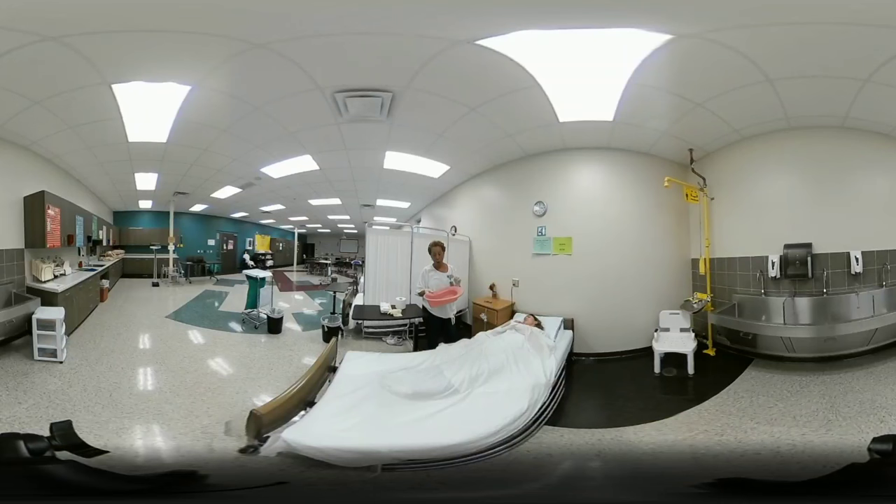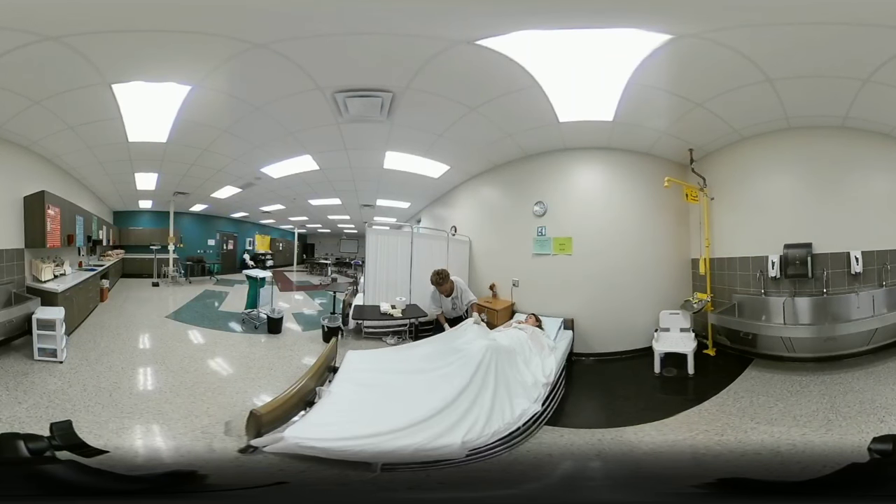When placing the bedpan — even though it's no longer a critical element — the step still requires you to place it correctly under the client's buttocks. The bedpan has a wide angle and a narrow angle. The narrow angle faces the footboard and the wider angle faces the headboard. To avoid overexposure, simply lift the sheet and gown, ask the client to raise her hips, and slide the bedpan underneath.